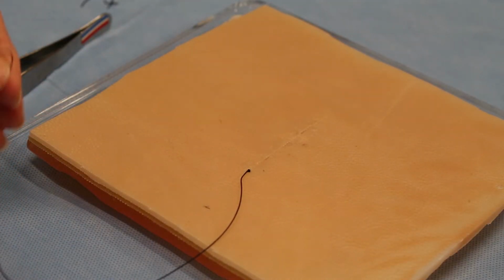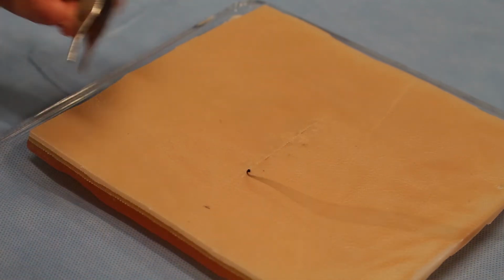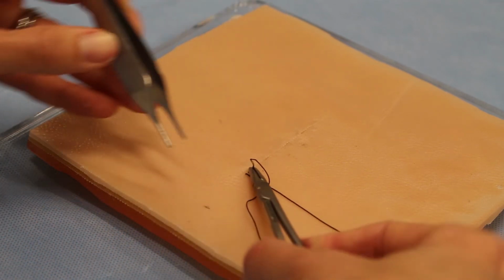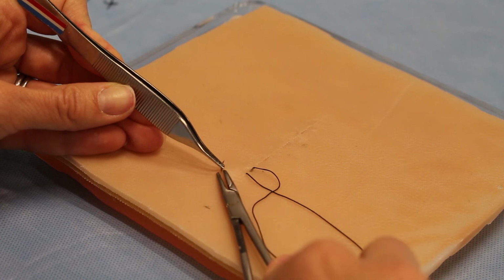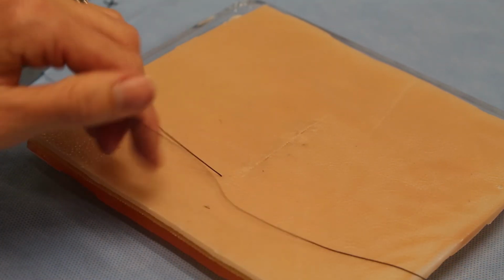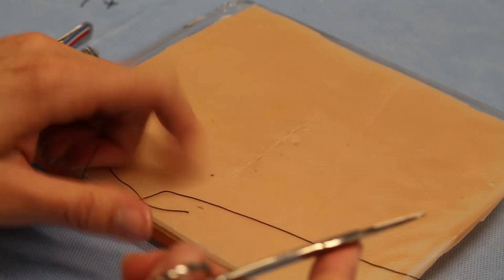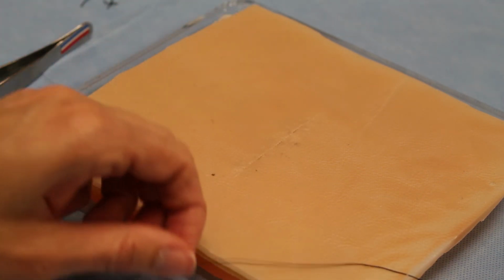Now, in order to make the knot go down where we know it's anchored, i.e. to bury the knot, I'm going to take this and I'm just going to stick this down where I know that knot needs to go, and I'm going to come out somewhere beyond the incision. And that will bury the knot. And then you'll hold this up and just cut it flush with the skin. Maybe. There we go. And then you have your whole closed buried suture. That's a subcuticular closure.